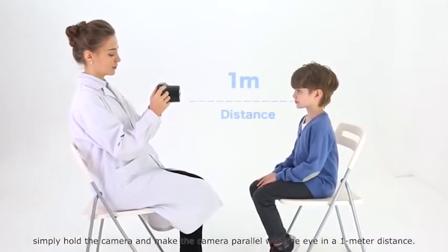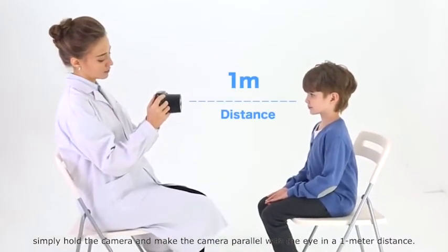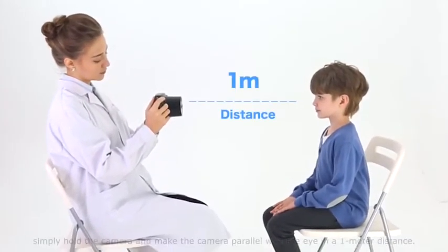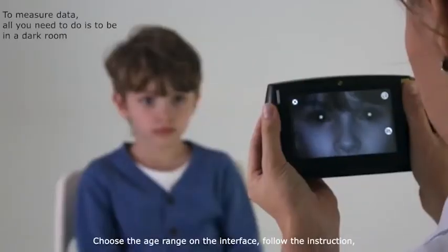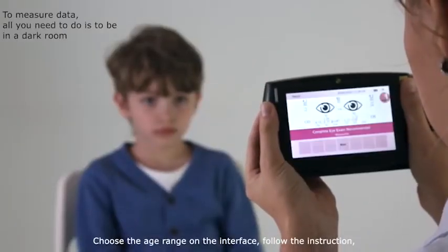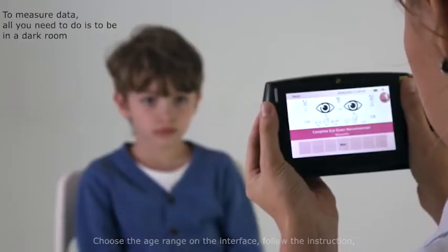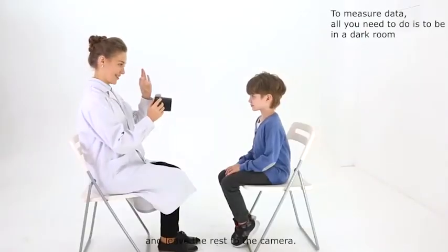Make the camera parallel with the eye at a one meter distance, choose the age range on the interface, follow the instructions, and leave the rest to the camera.